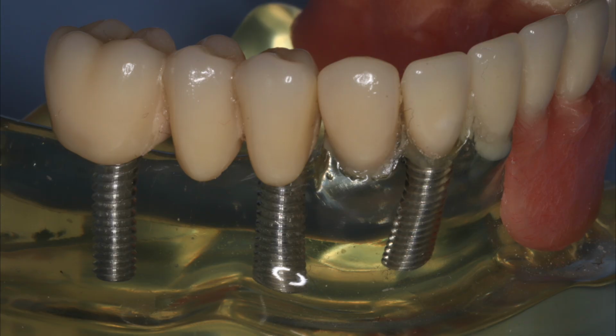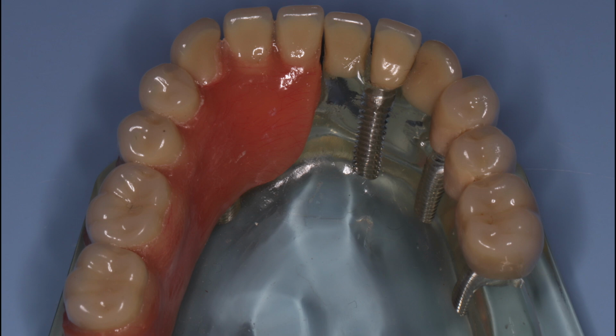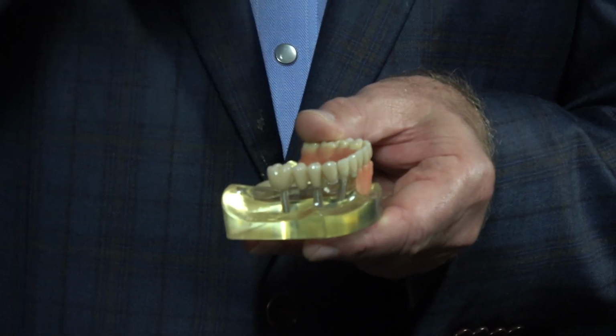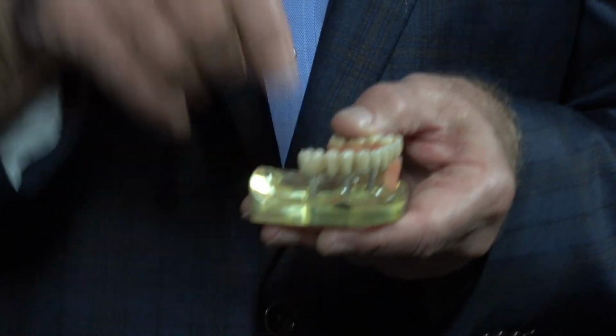The crown and the abutment come back, and you screw the abutment and the crown into the implant. So the implant itself is actually the part that's in the bone. You call the part that screws into the implant the abutment, and then you call the part that fits onto the abutment the crown.